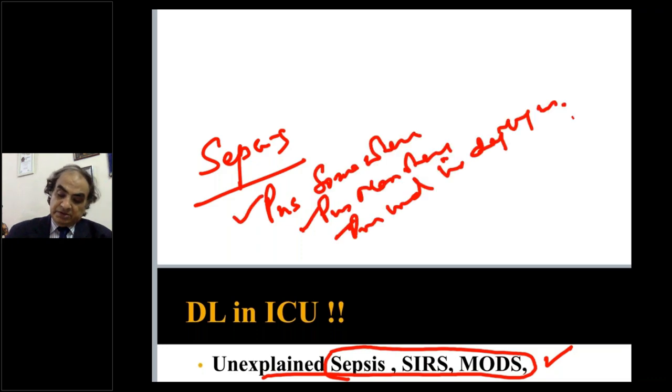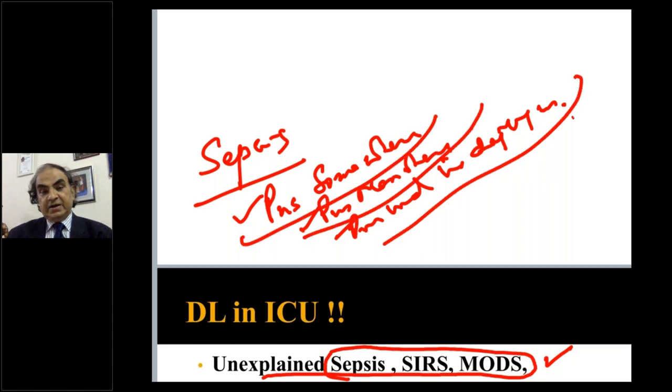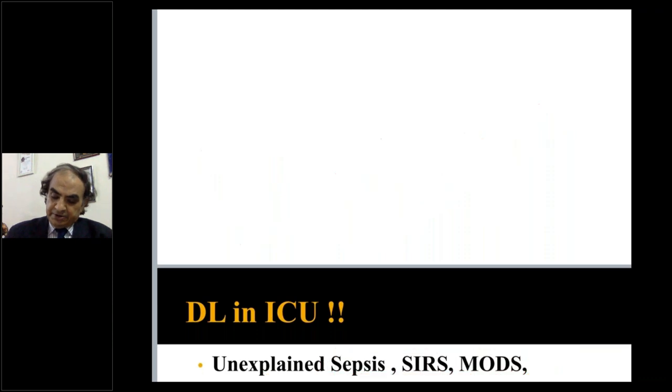This is for all of you to understand. Now, how would you find it out? Sometimes you cannot see it, but most ultrasounds will be able to show it. But if you want to drain it nicely and put a drain there and carry out a lavage, then we can possibly do it with diagnostic laparoscopy. So important. And I'm sure you all agree on that.